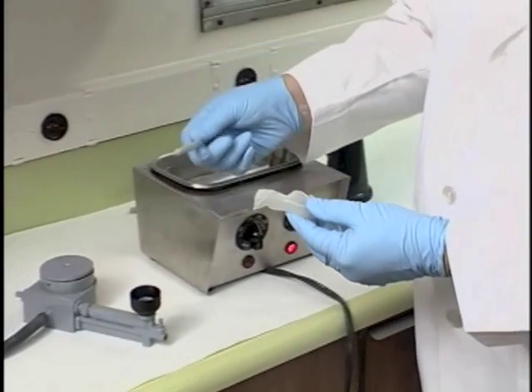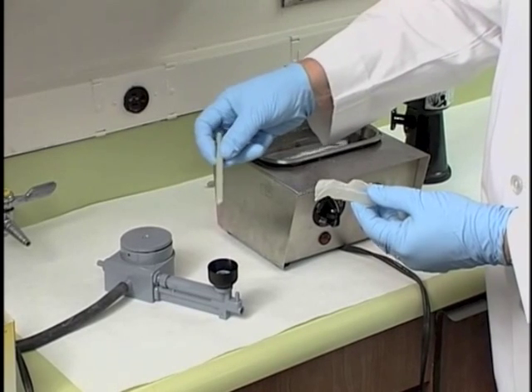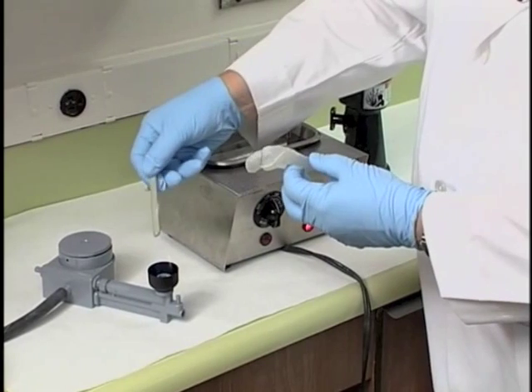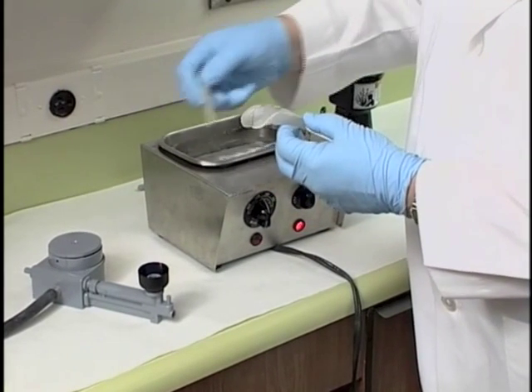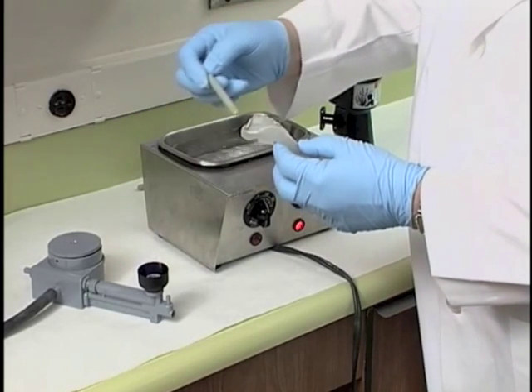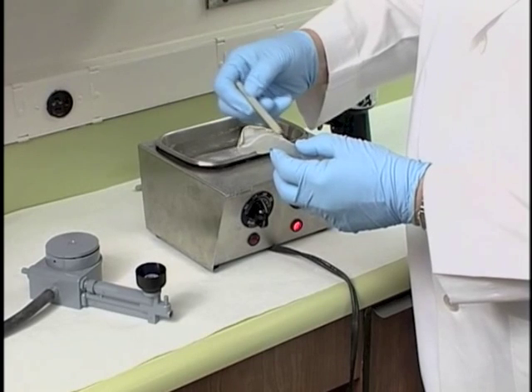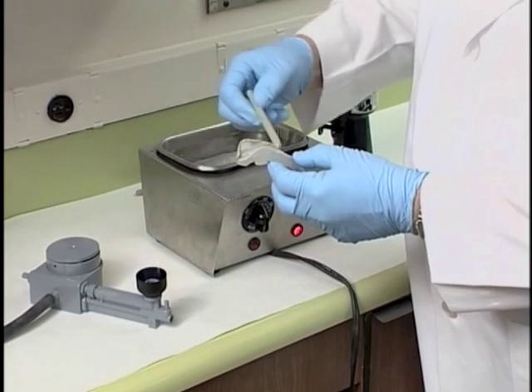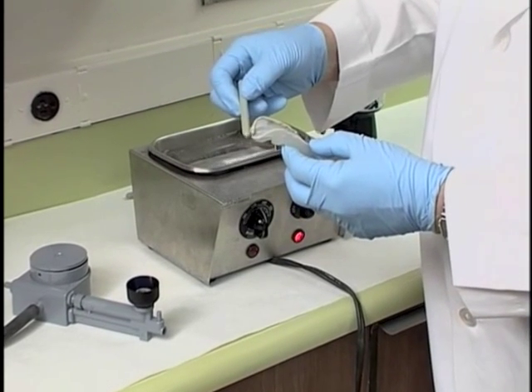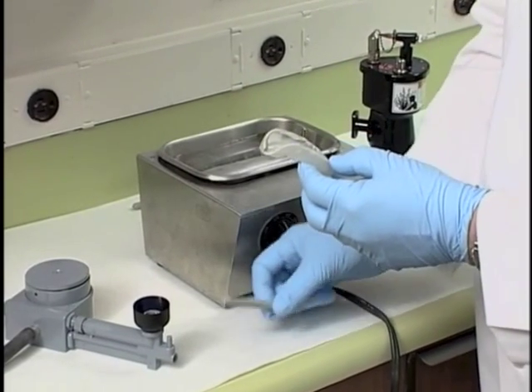We apply the compound just like we did on the maxillary one by heating the compound in the flame and smearing that molten compound or melted compound onto the periphery. I usually do this in 6 sections. We'll do both distal linguals from about the first molar or second premolar region posteriorly up to the retromolar pad, about that much material.